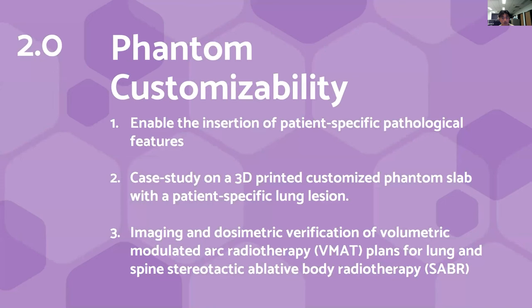Now, to quickly show you how 3D printing can enable customizability of phantoms, here we demonstrate the insertion of a patient-specific lesion in a 3D printed phantom slab, which emulates soft tissue, bone, and lung tissue densities in CT. And we use these for end-to-end testing of a VMAT plan for lung SABR treatment.